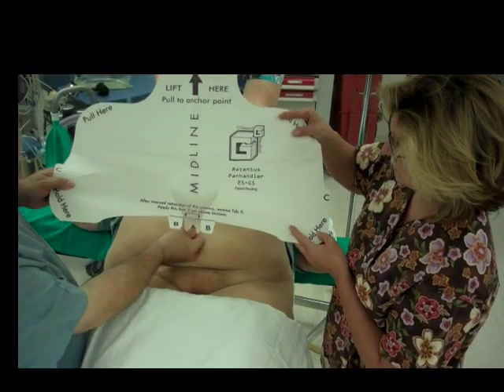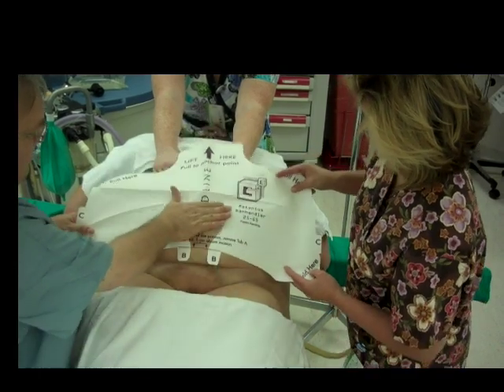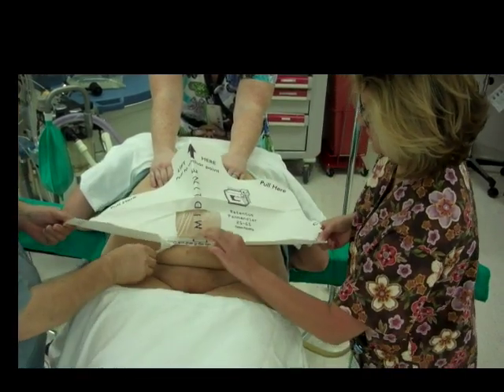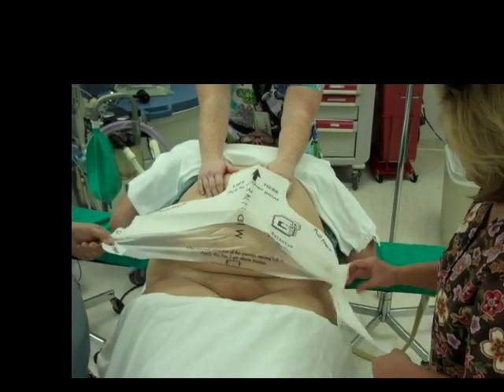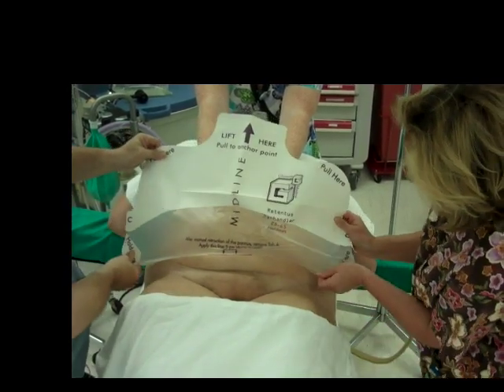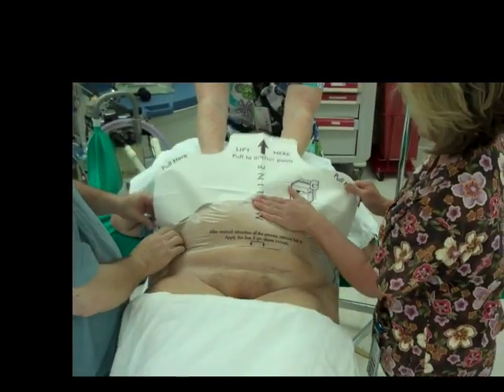Remove the A tab. Affix the edge of the retractor 5 cm above the incision. The adhesive is pressure sensitive. Now remove the B panels and apply to the patient, smoothing midline to hip. The person at the patient's head should release the pannus to fall back to its natural position.